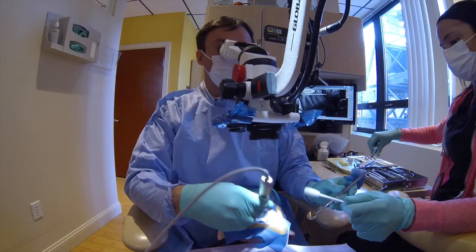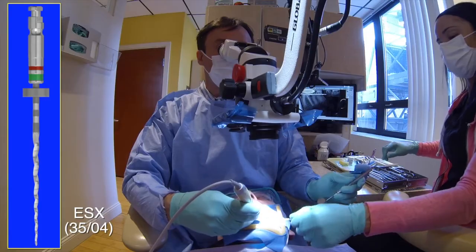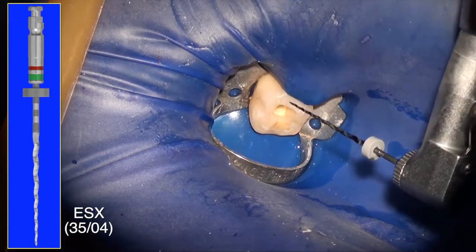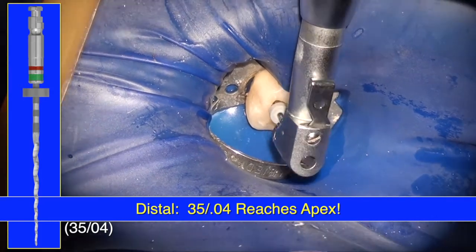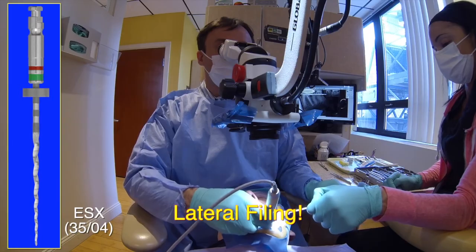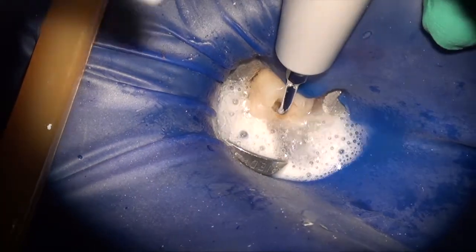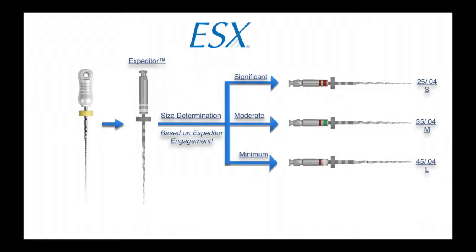On the distal, following the basic protocol, it looks like I should be finishing to a size 35 because there was not a whole lot of engagement. There was just about mild engagement on the way down. And as you can see, I went from a 1505, this is the third stroke here of the 3504, and at about 4 or 5 strokes, now I'm already down to the apex. And now I can do a little bit of lateral motion with my size 35, and there you go. Constantly single stroke and cleaning the debris from the flutes, using the ultrasonic and water here to clean any remaining debris.